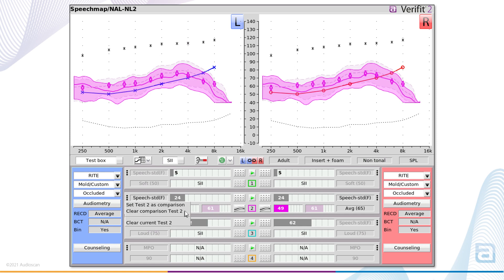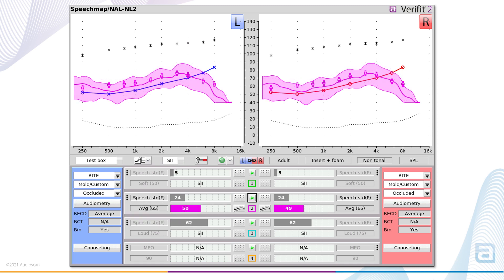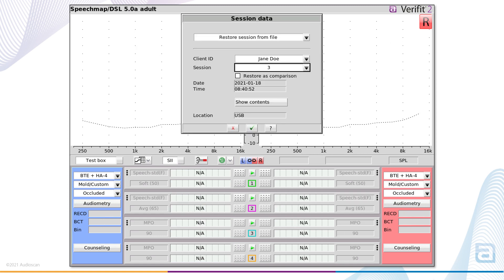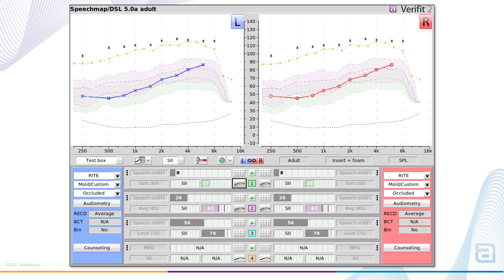To remove the comparison test from the system, open the new test menu again and select 'clear comparison test.' If you use the session store/restore function to save session data from the Verifit to a USB stick or network folder, there's a new option in the restore menu which allows you to load the previous speech map data directly into the comparison test slots. This would be helpful if you wish to run new measurements at a later date.